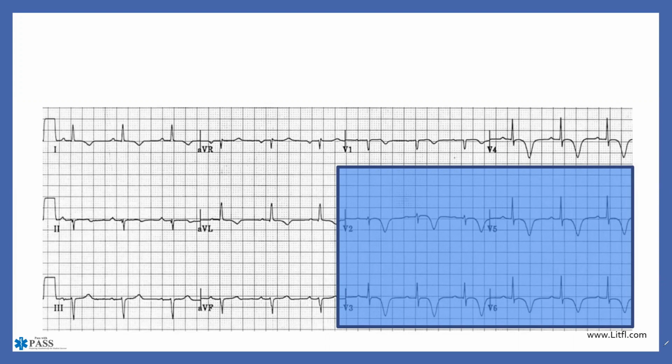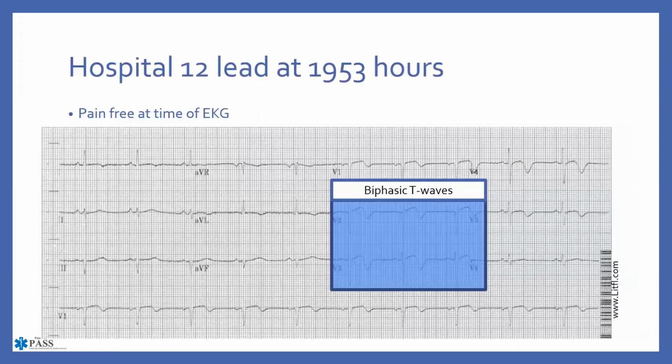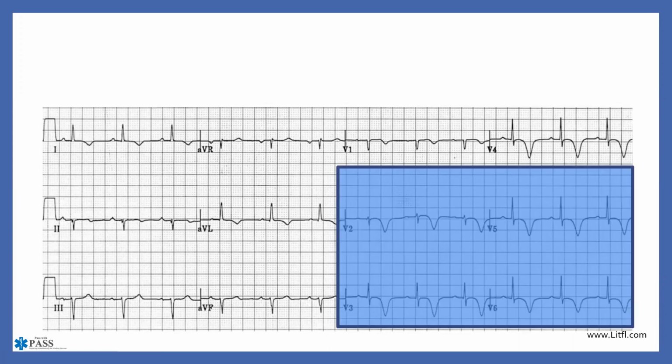So please do not get caught with your guard down in these situations. These patients should probably be evaluated at a reperfusion capable hospital. So there's your deeply inverted T waves, and on the previous one, I'll go back here, you have your biphasic T waves as well.